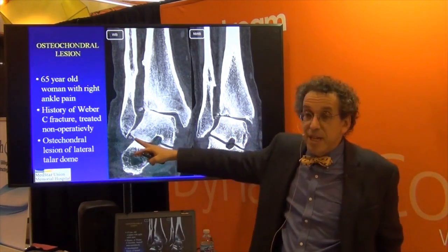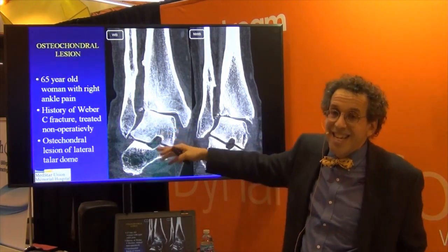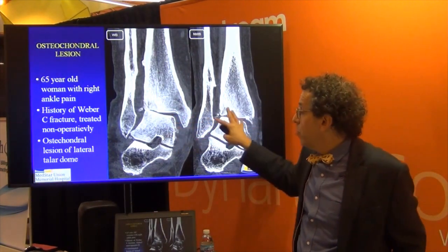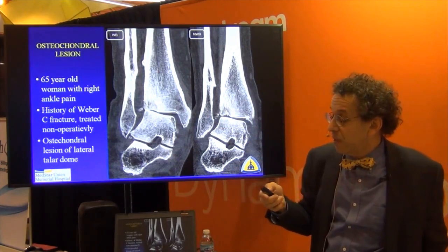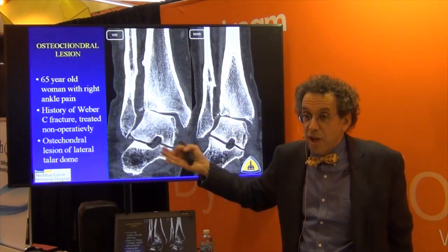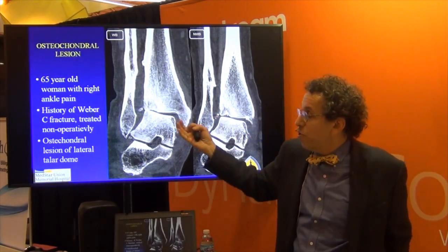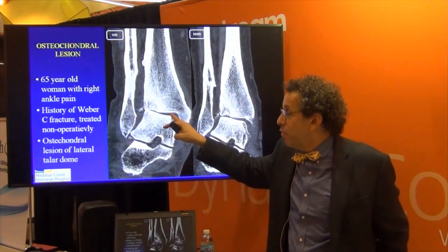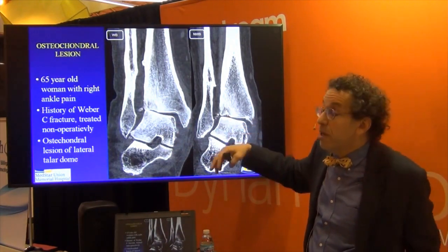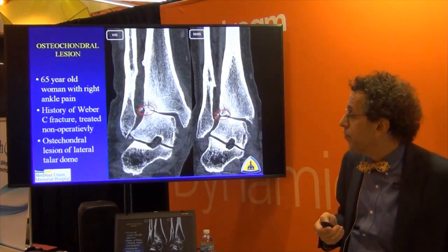You see the talus is abutting against the fibula, the medial clear space is greater, the syndesmosis is greater, and you have the talus sitting in this invagination in the tibia, and that is a more severe case than what you'd see with conventional imaging or a conventional CAT scan. And again, determining your treatment alternatives, you can still do your reconstruction and you can now follow it and see if your prognosis is good before you do your case. If it has more than 25% involvement, maybe the prognosis is questionable. Maybe if it looked like this with the weight bearing, you'd have a better prognosis. These studies need to be done and will now be done with the weight bearing CAT scan.